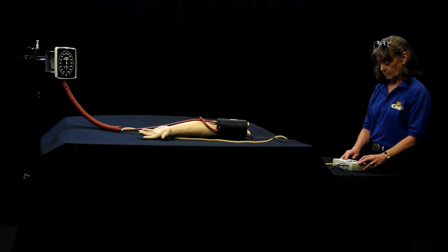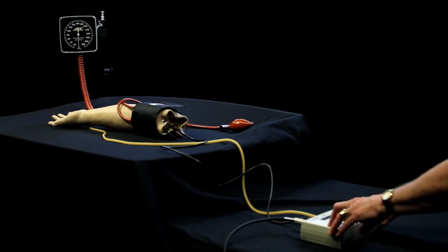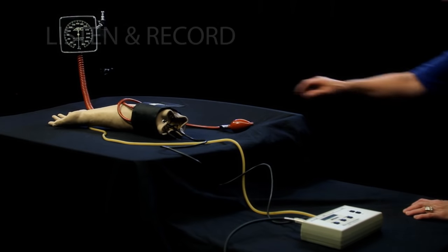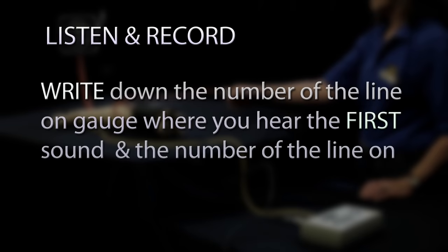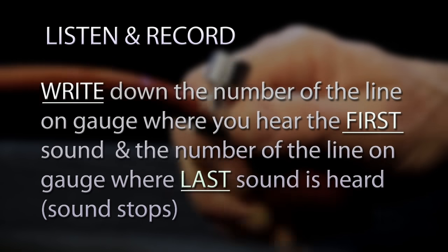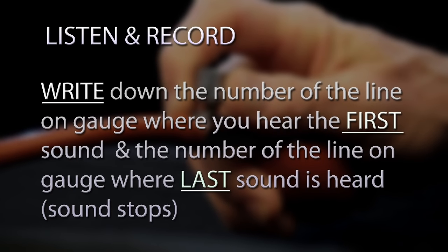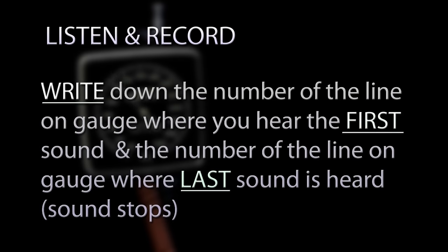Now for the moment you've been waiting for. These sounds are from a simulator arm and do not sound the same as a real person's blood pressure. But the idea is to listen for the sounds and mark where you hear the first sound and the sound stopping. We will listen to 6 different blood pressures and pause between each to give you time to record your measurement. After all 6 blood pressures have played, the answers will be shown. Here we go.